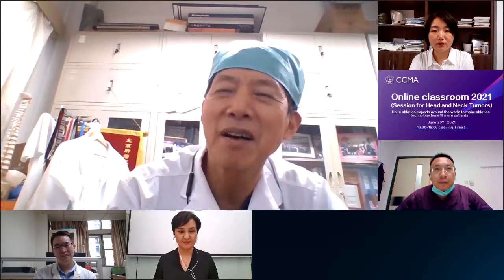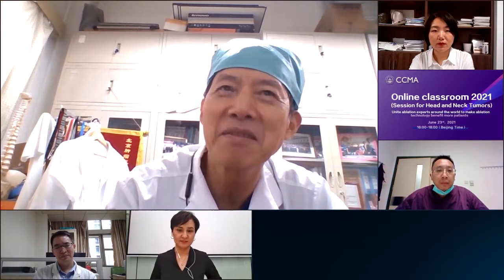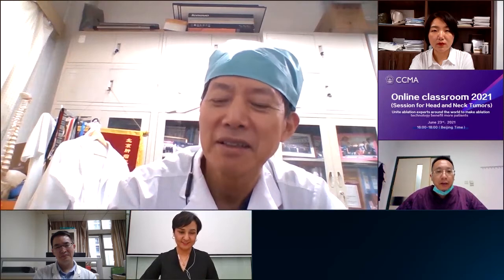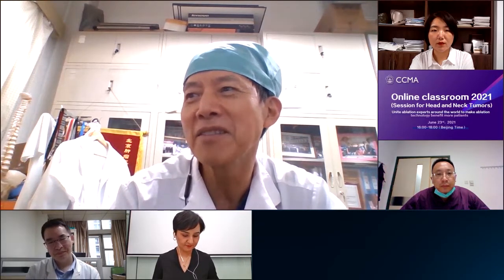I think the Egypt doctor can understand what I said in English. First, aspirate the liquid. Then we can ablate the aspiration tract, 就是消融一个针道，消融的抽吸针道。Ablate the aspiration tract, the needle tract. So another key point is ablation of the needle track, which prevents bleeding. Okay. I think it's clear for this question, right? Dr. Long and Dr. Tang, do you have some comments?